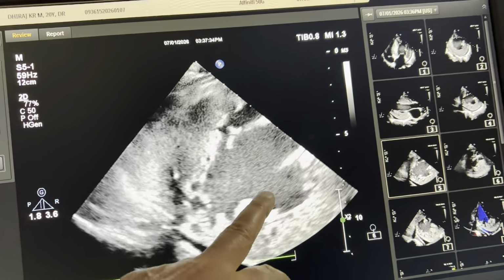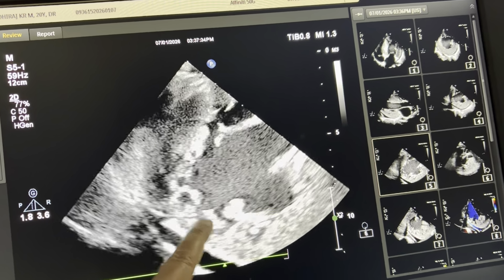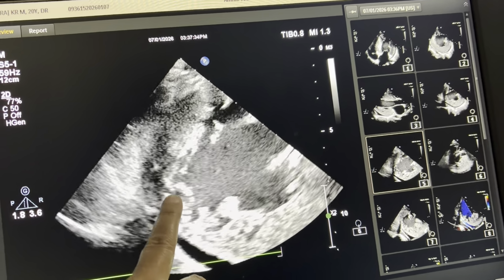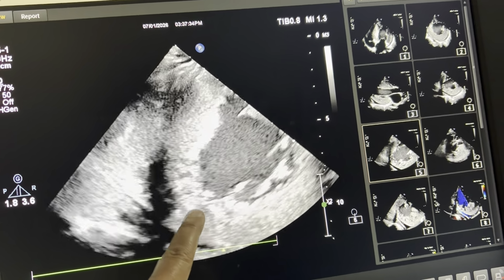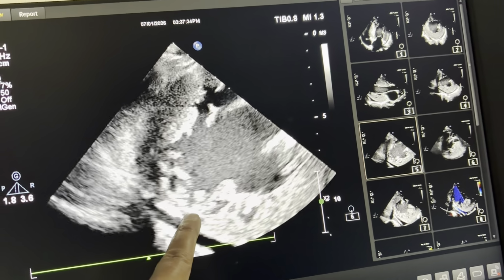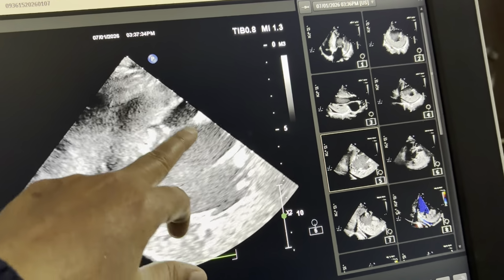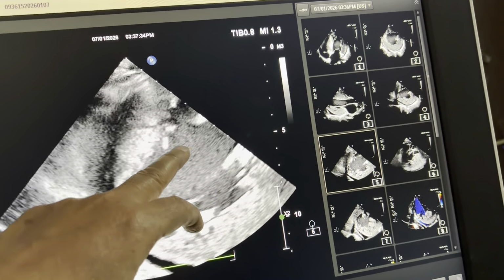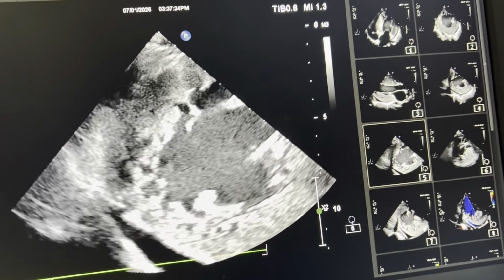This case has already developed left ventricular systolic failure. You can see the inferior wall of the left ventricle, and lots of muscular bands and a space between them, and that space is communicating with the left ventricle chamber. You see the blood flow into the left ventricle; because the flow velocity is low, the blood flow contrast is easily seen in this image.